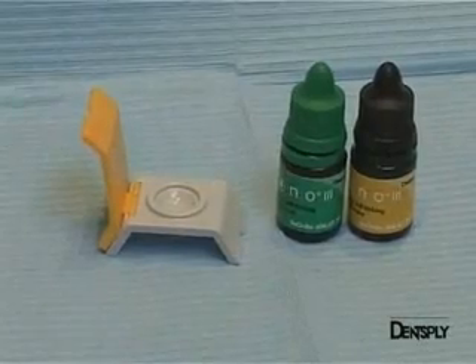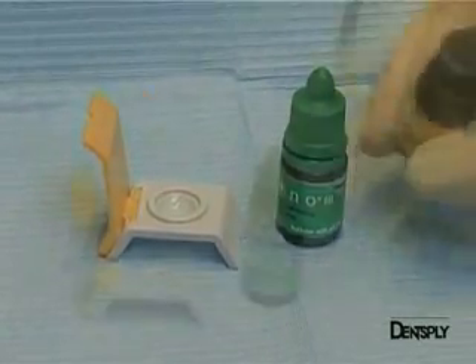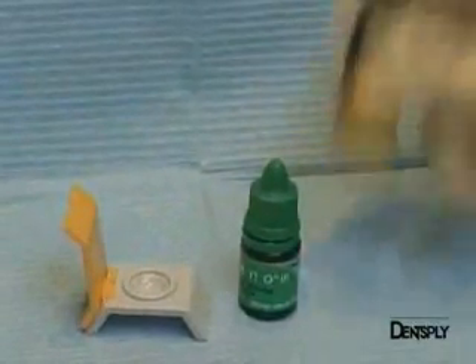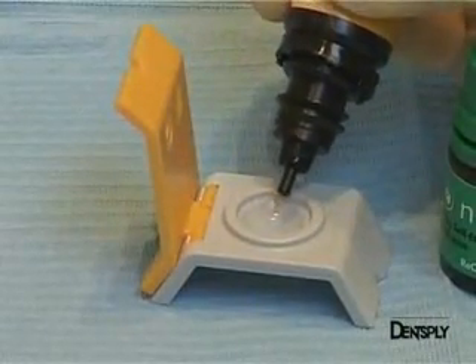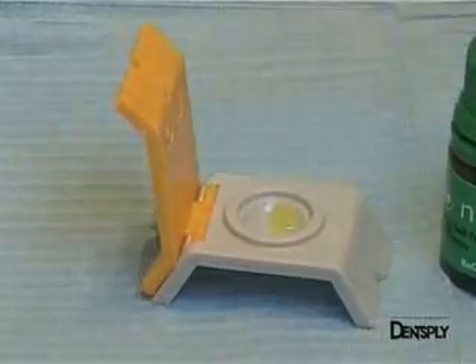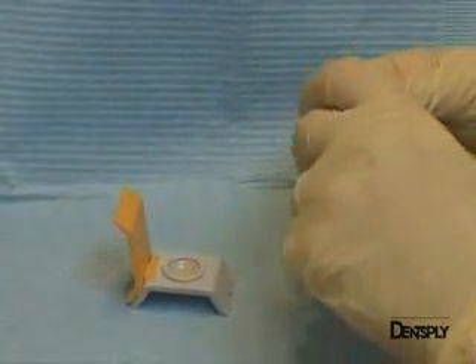The adhesive system used here is Xeno3, a single-step self-etching adhesive, which is of particular interest for posteriors as it minimises the risk of post-operative sensitivity. With this type of system, all the dentine that will be demineralised by the acid polymer will simultaneously be impregnated by the same monomer, which will be photopolymerised before placement of the composite occurs.